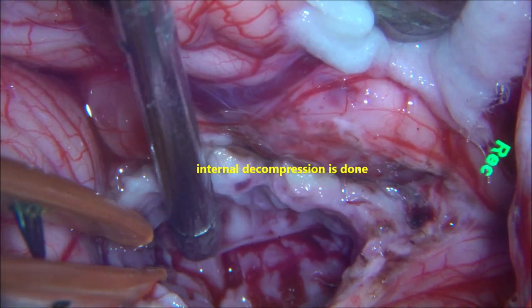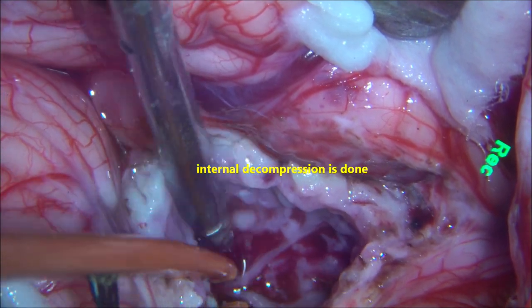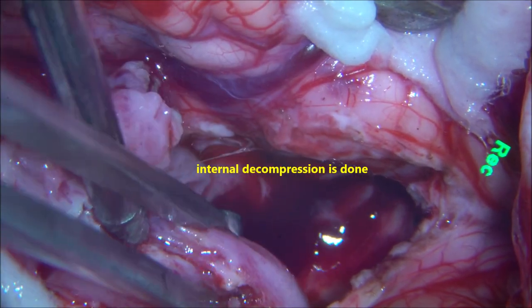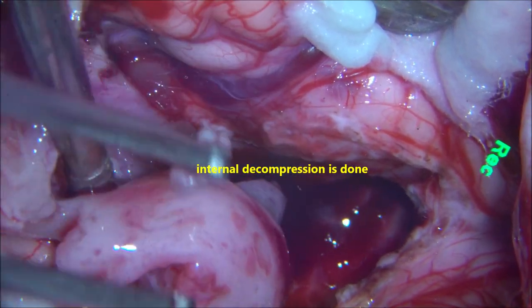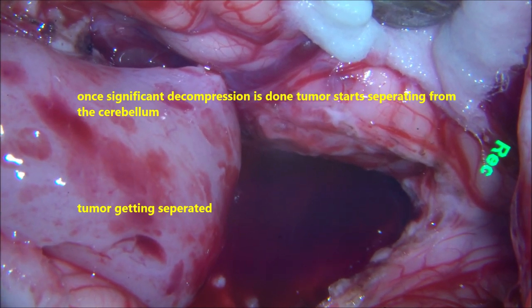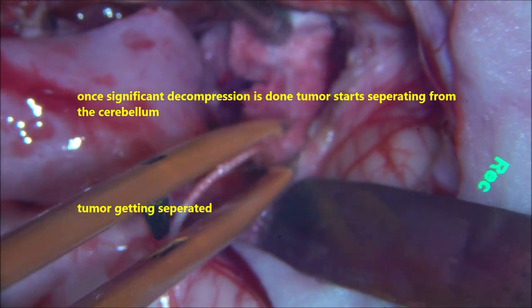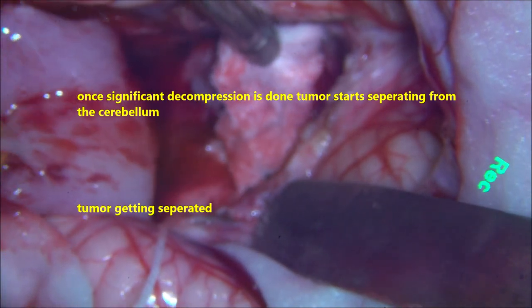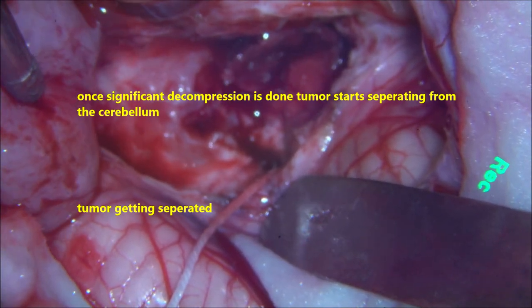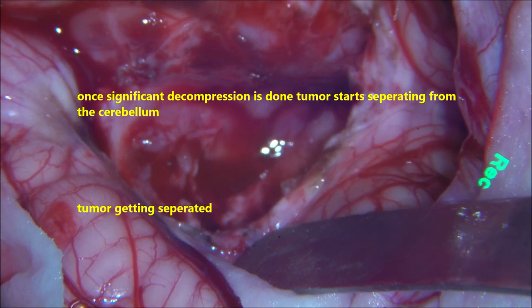Internal debulking is done and bleeding is stopped with bipolar coagulation — hemostasis is achieved. It is always better to have hemostasis at every stage. Once the internal decompression is done, the tumour starts getting separated by itself from the normal surrounding cerebellum. The tumour is quite well encapsulated, and once you do the decompression it starts separating. The raw surface of the cerebellum inferiorly and laterally is covered with wet cottonoids, and the inferior lobe is taken out completely.